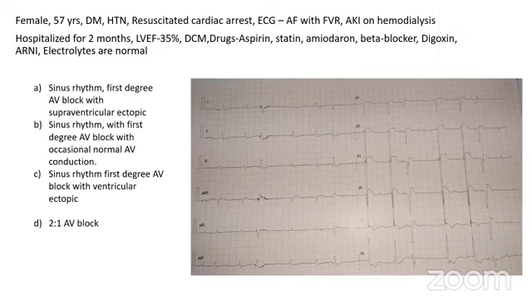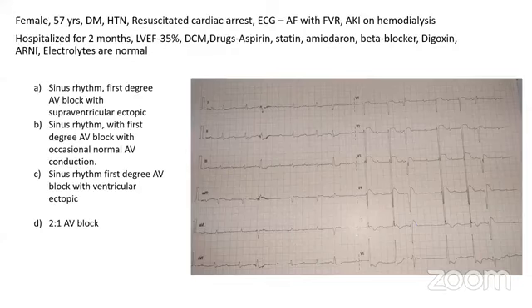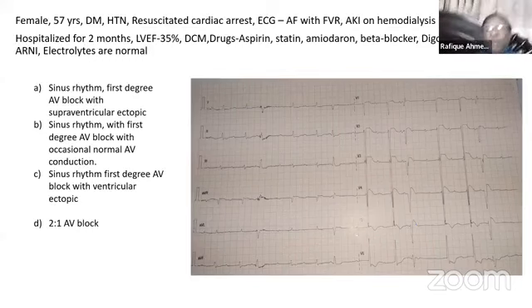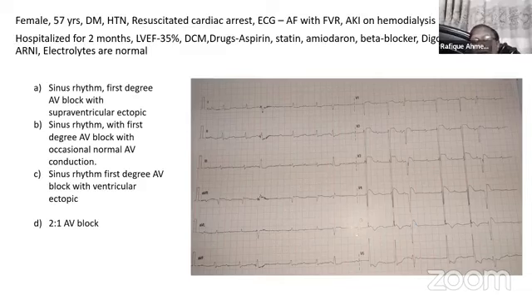Sir, Rafiq sir. Yes. Sir, because of the variation in the AV conduction, the second one is a bit more prolonged than the first one. Does this prolongation of the conduction through the AV node change its conduction velocity in the third beat? Every third beat is conducted with aberration. Well, you can explain it with the simple pattern of rate dependent aberration, because that beat is coming early. It is just like any other rate dependent aberration, or what we see with aberrant conduction with supraventricular premature beats.